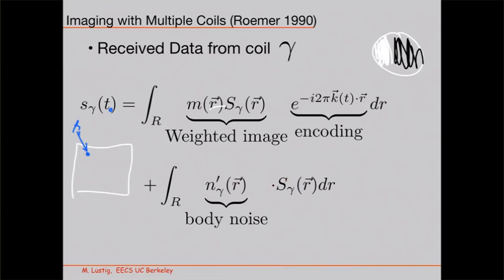So what I will get is some signal, which is M times whatever, and an additive noise to it. For a single channel, how can I characterize that noise? I can characterize it by its distribution. And what is this distribution?